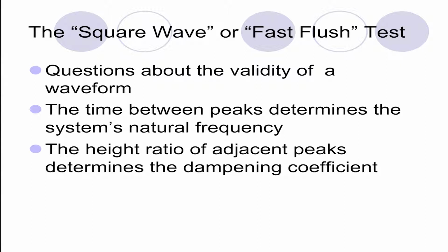I'm not seeing exactly what the problem is. So I check everything, happy with it, come out, and she said, well, you didn't fix it. And I said, well, I couldn't find what was wrong with it. And she said, well, her pressure's still high. Well, that's the patient. We blame a lot of things on lines. You know, you hear all the time, my art line's running high, and we'll talk about why that is. Or I also got, respiratory therapists are putting in art lines now. They're doing a fabulous job.